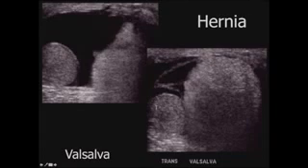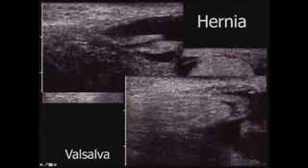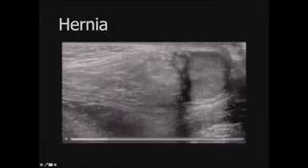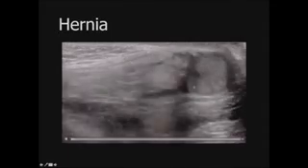In this case, we have a normal testis, hydrocele, and some unclear mass. With Valsalva, this large fatty mass increases greatly in size. Another way, looking within the inguinal canal, here you wouldn't say there was anything going on, but with Valsalva, you get this protrusion of abdominal contents, again, in this case, omental fat. And again, just in this short video clip, if you took the image at this point, you would see nothing, but with Valsalva, you get protrusion of abdominal contents down superior to the testis.